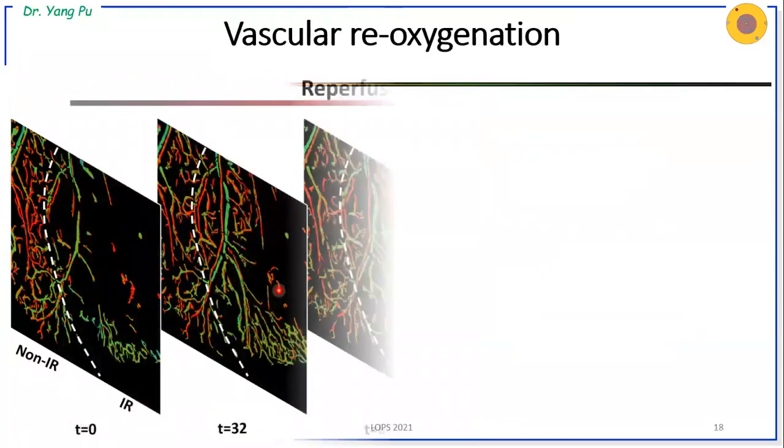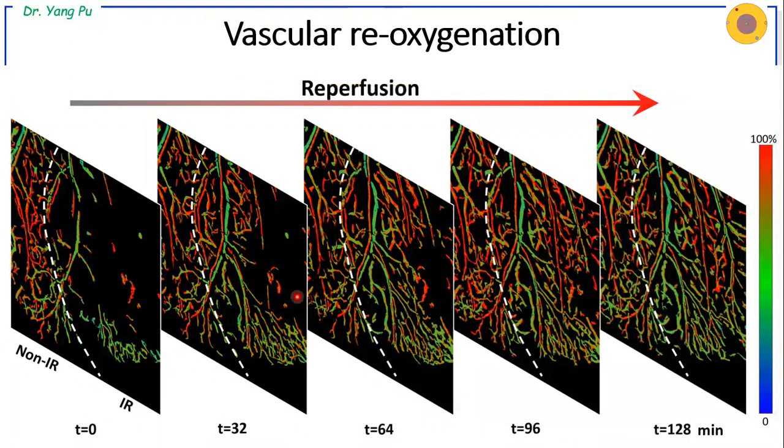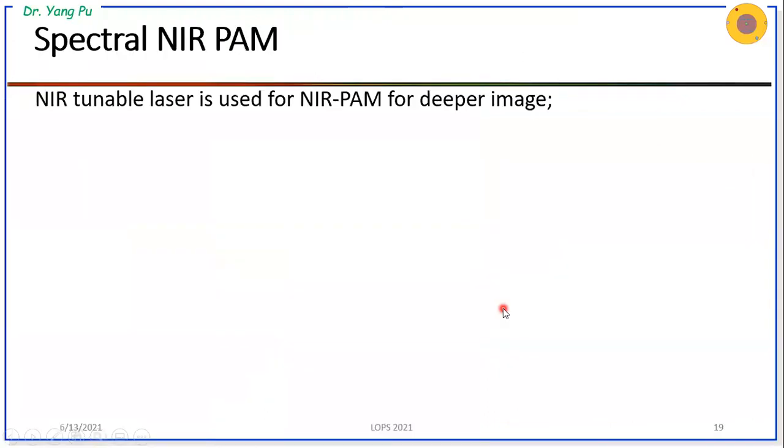This is our result. This slide shows the oxygen saturation SO2 map along different times. Now we can distinguish the artery in red color and the vein in green color clearly. In the next several minutes, I would like to mention a little bit about our ongoing project.